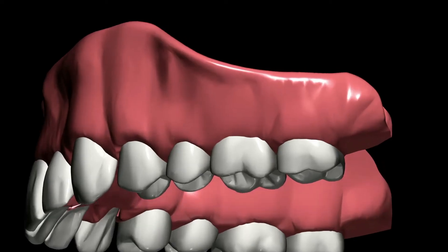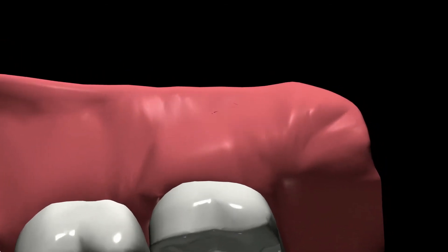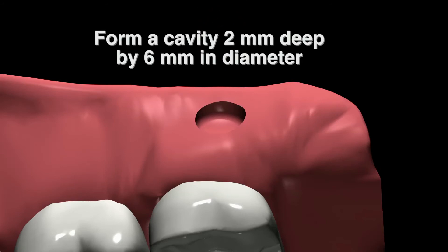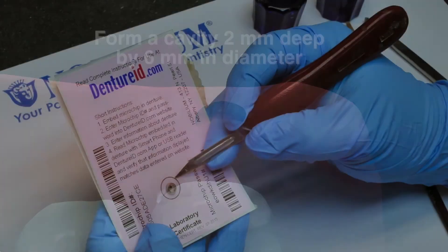Step 1: Use a round or pear-shaped acrylic burr to form a shallow 2 mm cavity in a posterior buccal flange. Then use an inverted cone burr to form a cavity 2 mm deep by 6 mm in diameter.